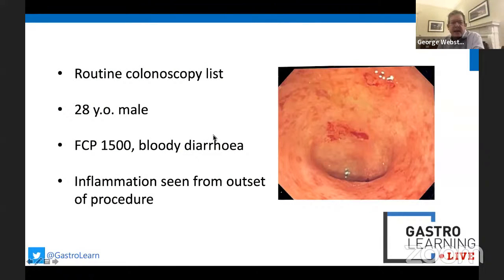So let's start off, Mark. I mean, it's great to have you with us. Let's start with a basic clinical scenario. And that is the 28-year-old man who has been seen by his GP. He's got chronic diarrhea with some blood. He's had a fecal calprotectin of 1500, and he has been referred, I think not unreasonably, for a colonoscopy. And this is what one is seeing in the rectum. So, common clinical scenario, and I suppose, simple question, what do we do next?